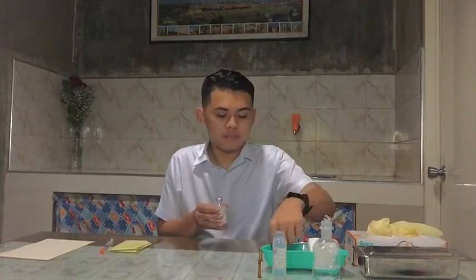Next is preparing medications for the subcutaneous route. Here, we will be preparing the medication vial for drug withdrawal. Again, mix the solution by getting a vial and rotating the vial between palms, and remember, do not shake. Then, as I have said earlier, clean the rubber cap of a previously opened vial with an antiseptic wipe by rubbing in a circular motion. As I have said also earlier, some vials contain aqueous suspensions which settle when they stand.